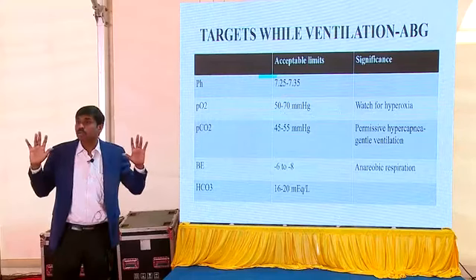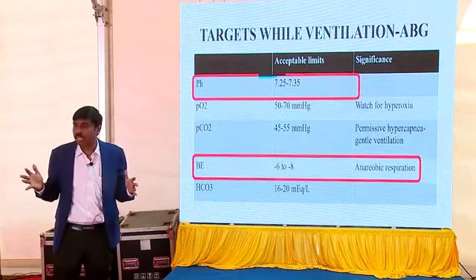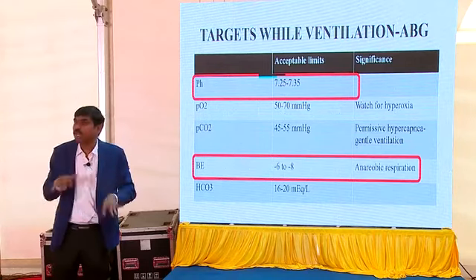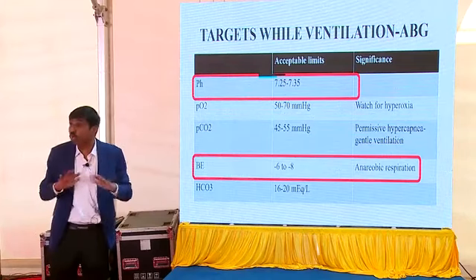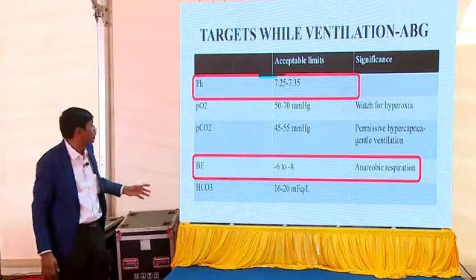Working with a ventilator without a blood gas, an ABG, is like using a computer keyboard without a monitor. You just keep on typing something, but you won't know what's actually happening. So ultimately, you need to know what's happening at the cellular level of the baby.